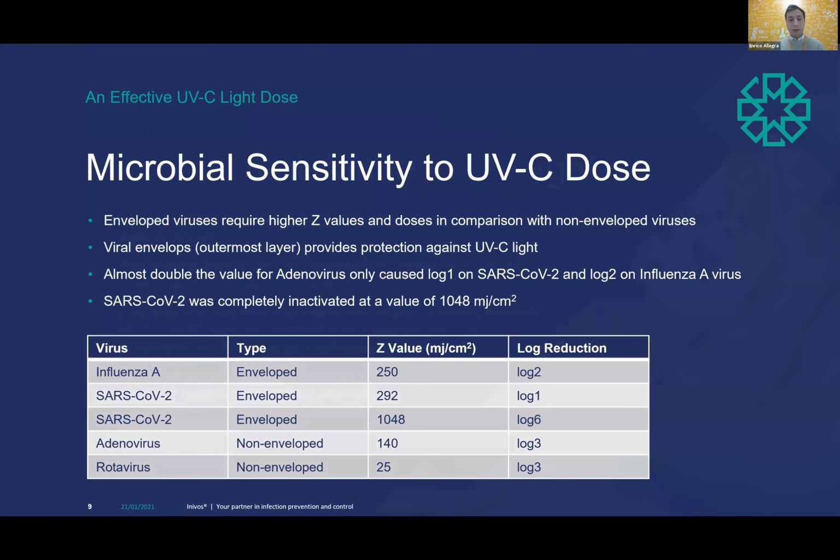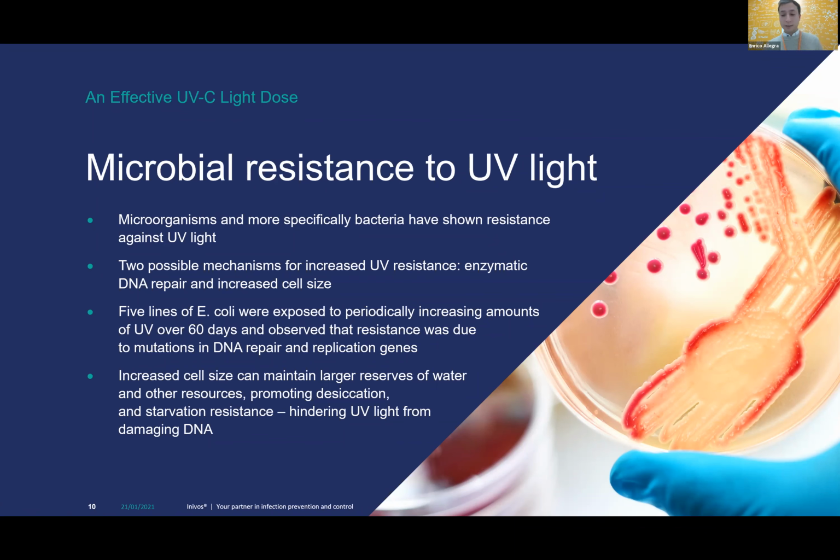So moving on to my next slide, I'll go very quickly through the last 2 slides. We just wanted to introduce this concept, which we've seen in the literature now and which more people have started talking about: microbial resistance to UV light.